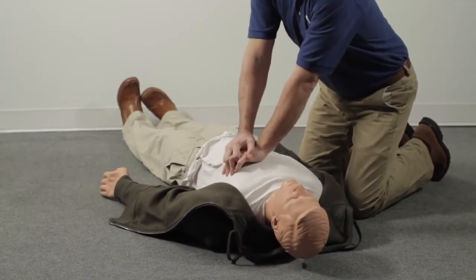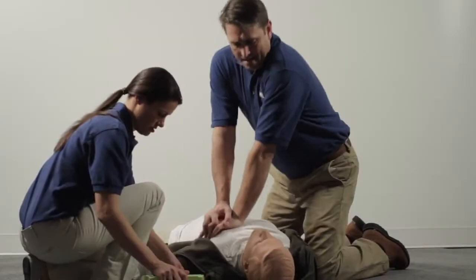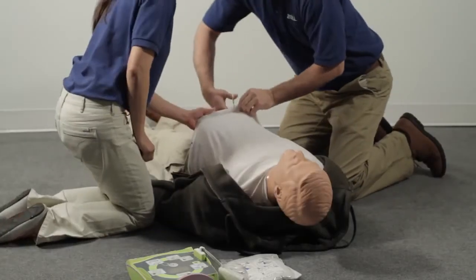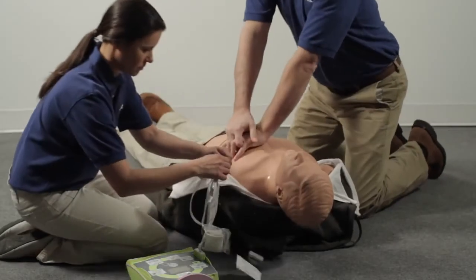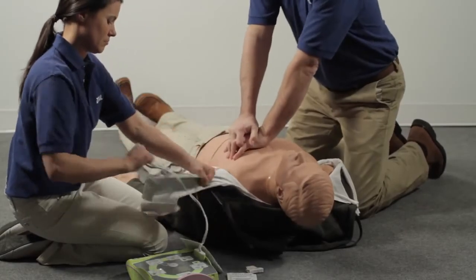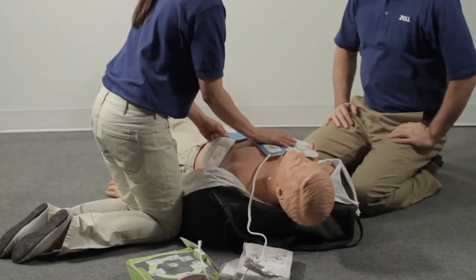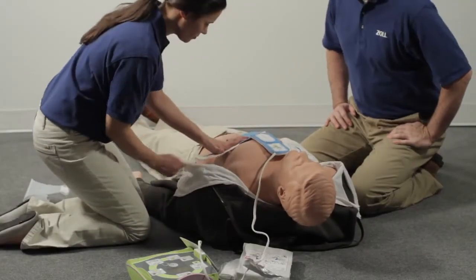Continue compressions and rescue breathing until the AED arrives. When it does, make sure the person isn't touching water or metal. Place the AED Plus by the person's shoulder and turn it on. Proceed immediately to attach the electrode pads to the victim's bare chest. As soon as they are applied, the AED Plus will begin analyzing the heart rhythm. It will not prompt you to do what has already been done prior to attaching the pads.